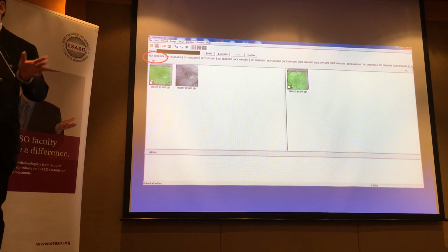Another example which happened somewhere, I won't name the guilty, but basically, and I know why, because I examined the patient later. This patient was being followed up for diabetic macular edema, and it was reviewed. The patient had a bit of senile ptosis, not the most cooperative, looks all over the place during examination. But the person who saw documented no clinical evidence of edema, great, and on OCT was normal. All of which was correct, by the way.